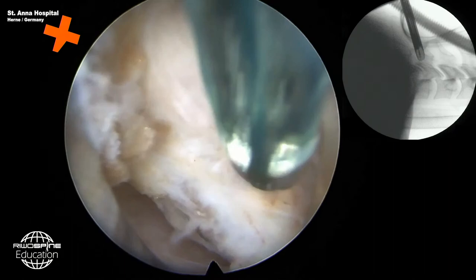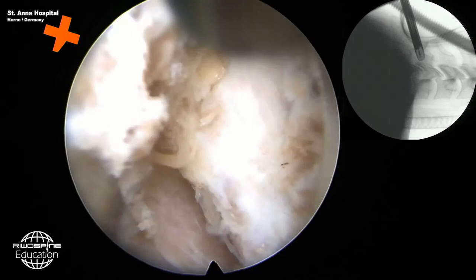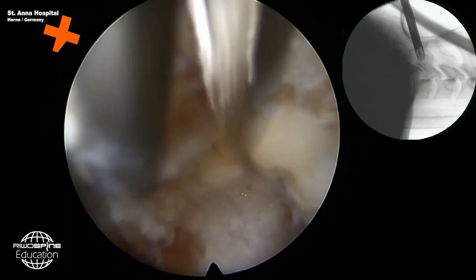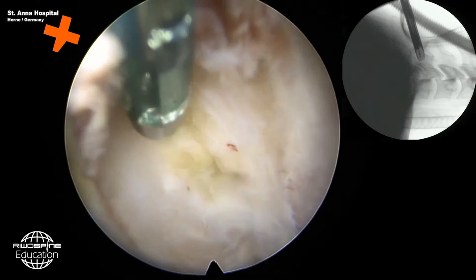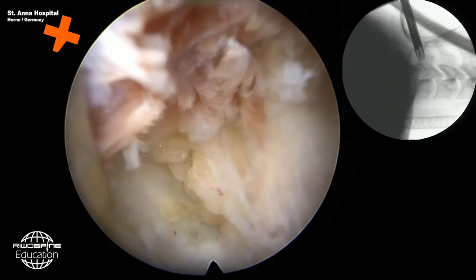So we're operating, right side is cranial, left side is caudal. Here's the way to the medial aspect, here's the way to the lateral aspect. So the next thing is we have to follow the bone to the medial aspect and prepare the interlaminar window. So here starts the flavum ligament. It's the joint here. Then I need the small rongeur right away.